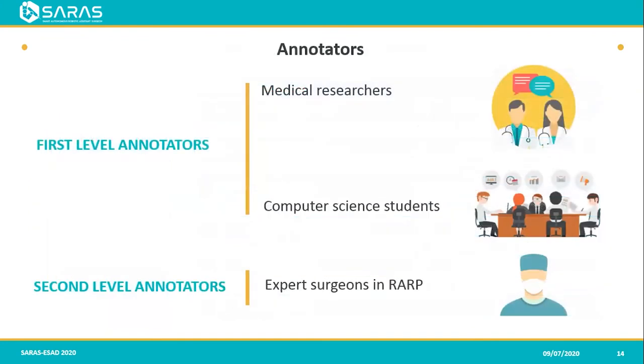But who are the annotators? They are at least three independent annotators. The first level annotators were medical researchers with 2 years of experience in prostatectomy surgery and a background in laparoscopic surgery, and computer science research students who have been working with the surgeons for 2 years. The second level annotators are expert surgeons in laparoscopic and robotic radical prostatectomy. Disagreements between annotators were resolved through continual discussion.